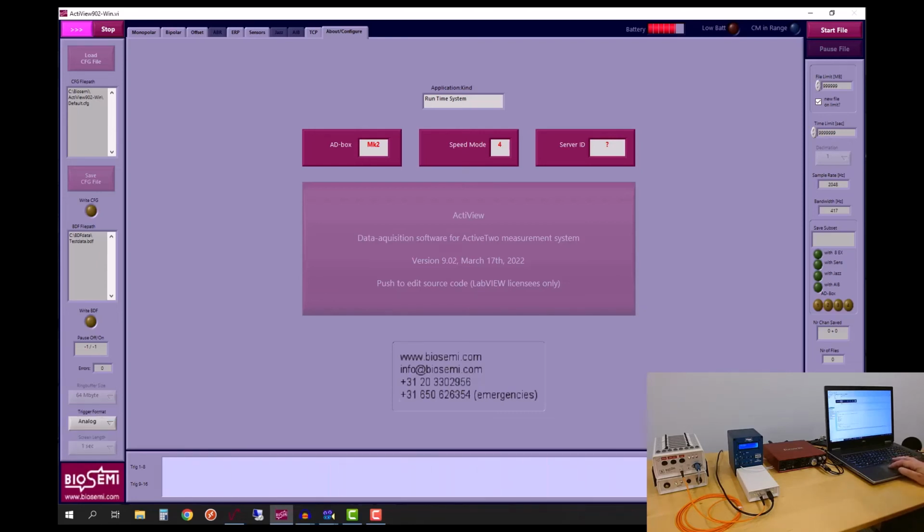What I would recommend when you're using Triggy is instead of using the serial port trigger cable, you tell your experimental control software just to play the sound, and then you'll be seeing here on the trigger section for the recording software, just that 1 bit, and that's the bit that's being raised by the receipt of the sound from the audio device.